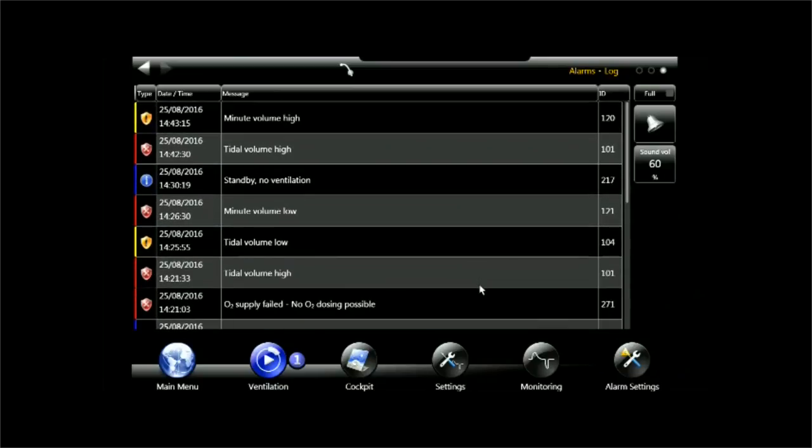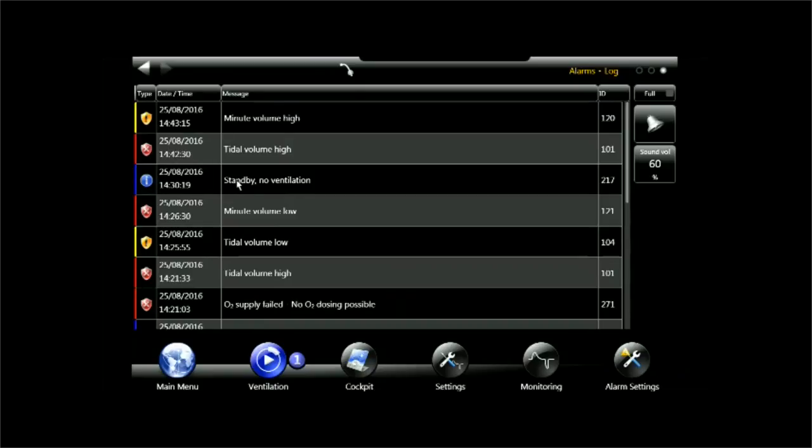So what we see here is we see the two alarms we just had, minute volume high and tidal volume high and before that the ventilator was in standby. And before that we had yet other alarms. So here completely all alarms, a list of 2,000 alarms long is accessible.